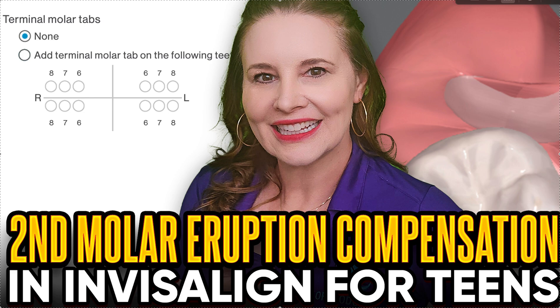There could be one for third molars too. When you submit a case that you mark teen for — you have to mark teen to get access to this — you're going to get to this part, which is terminal molar tabs, and they're going to ask you if you want them.